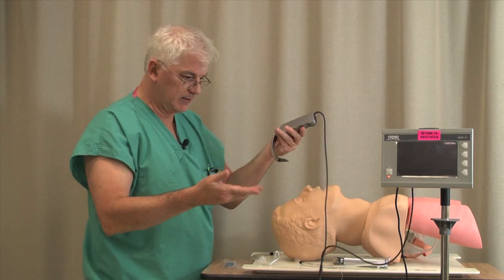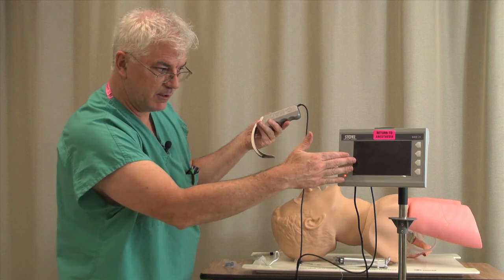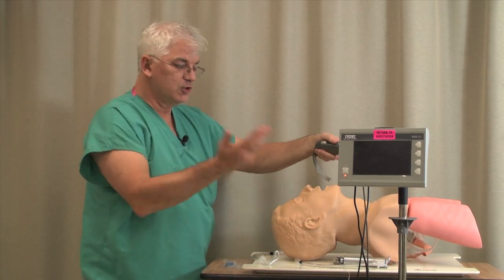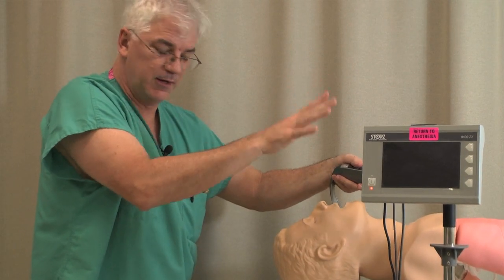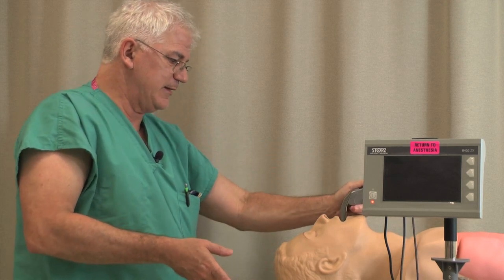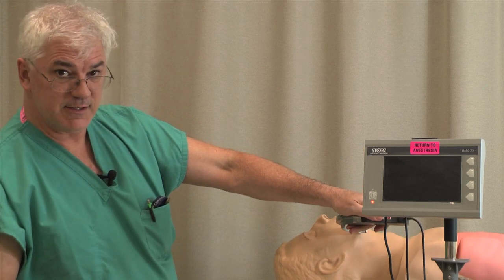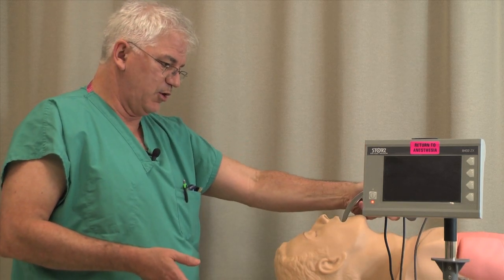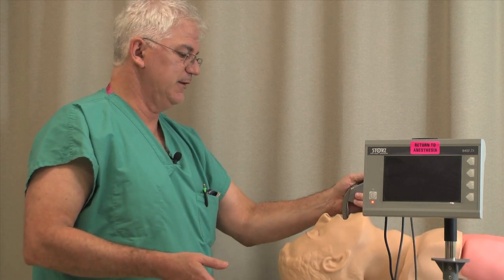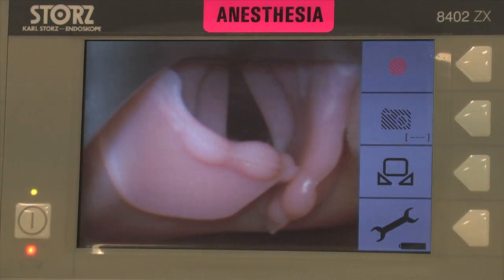Let's go ahead and get into things. I'm going to turn this so that the camera can show this stuff, but I'm going to show you what I do. We've induced the patient, we do all the other things we've talked about in other videos, and now it's time to do the laryngoscopy. Notice how I go right smack dab in the middle — you don't see me going way off to the side. I put the scope in right smack dab in the middle, and then I lift straight up, and then most of the time, bingo, you get a very nice view.